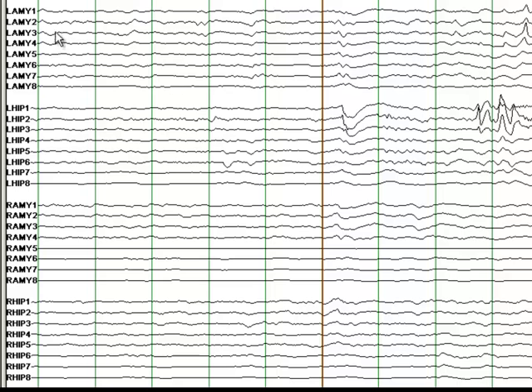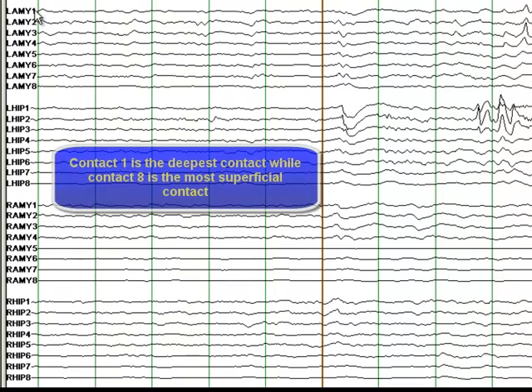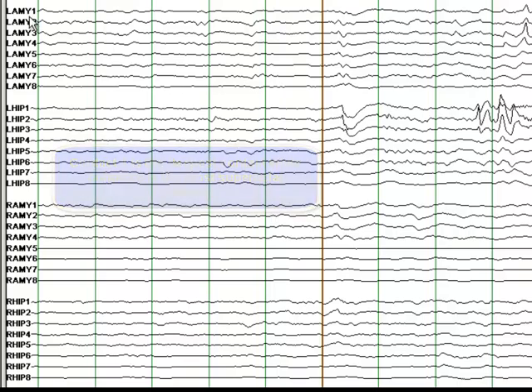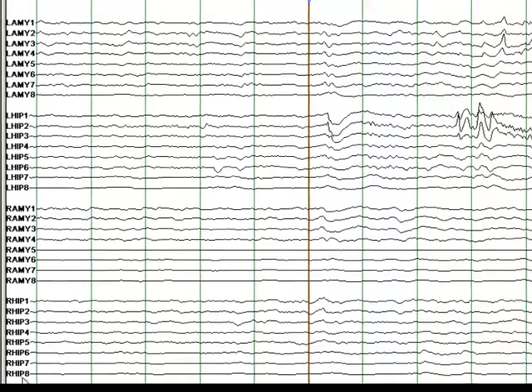What you need to know is contact one is the deepest contact. Each probe has eight contacts, so this is one to eight contacts. Here this is the left amygdala probe, this is the left hippocampal probe, right amygdala probe and right hippocampal probe.